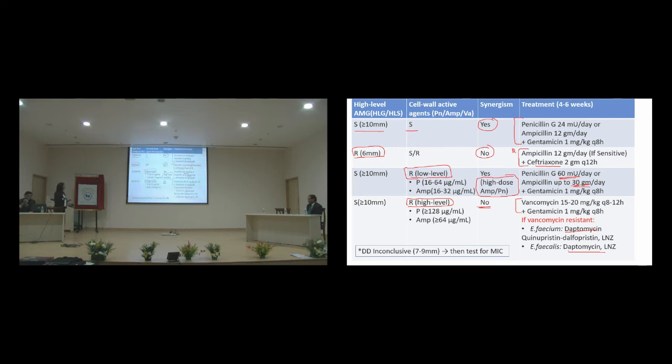Okay? Just one point I want to stress on, that we are talking about a possible synergism in vivo by testing for high level gentamicin resistance in vitro. So that must be very clearly understood here. So this is a kind of a surrogate test to predict whether we expect in vivo synergism between the two drugs or not.